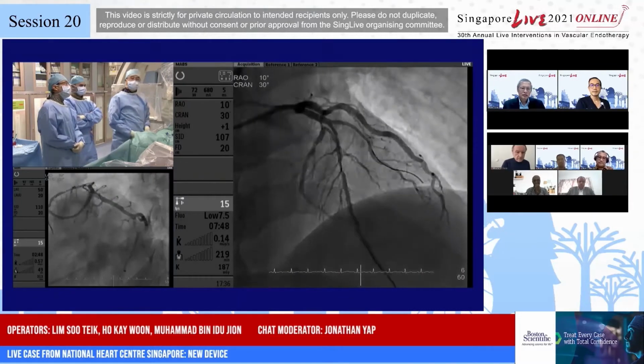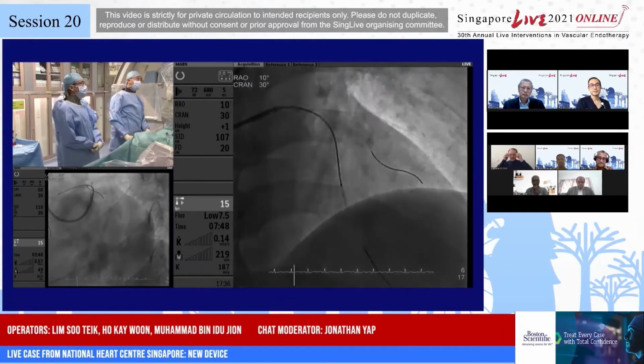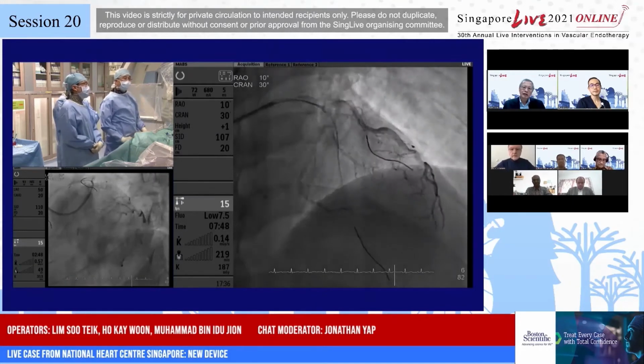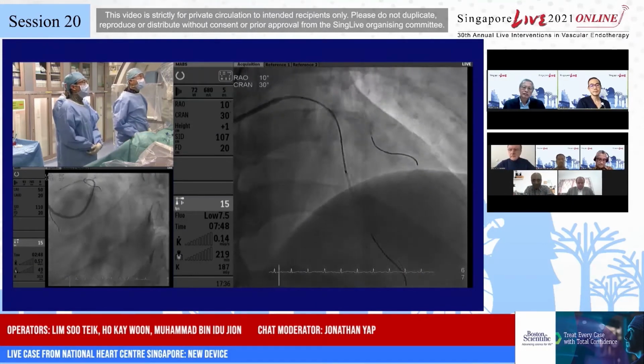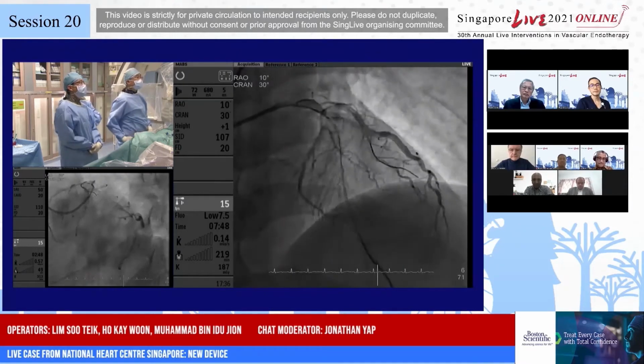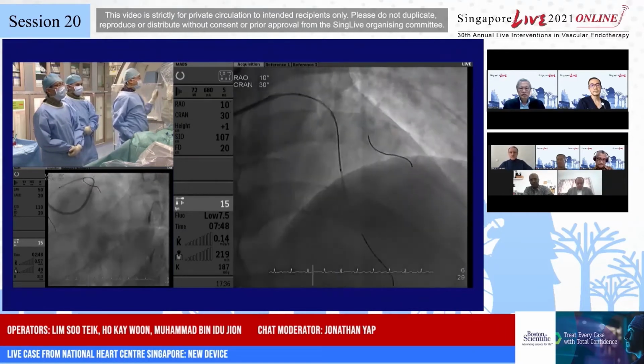Yeah, Adrian, thanks for the suggestion. But it's a little bit too late to do that now, because we have pre-dilated. While waiting to go on air, we pre-dilated this one.